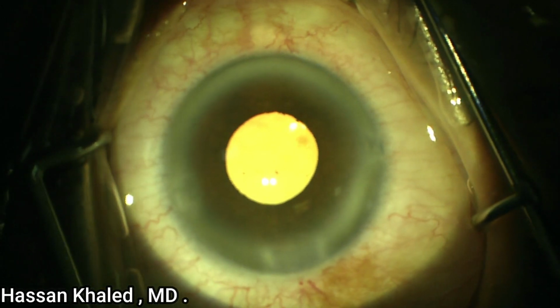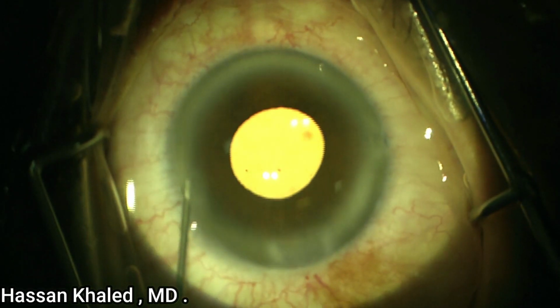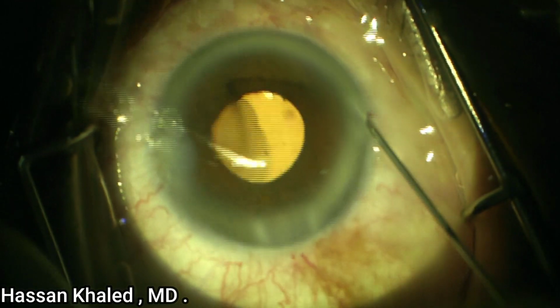And also one important step is to do irrigation by the end of the surgery inside the anterior chamber to be sure that there are no hidden pieces in the angle.